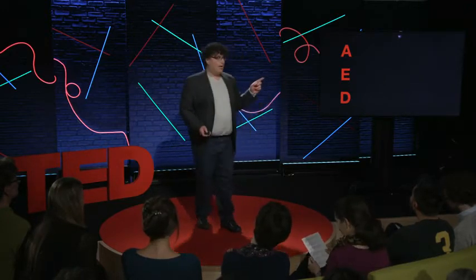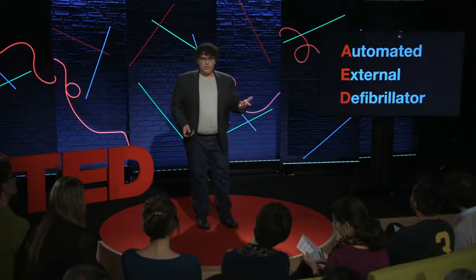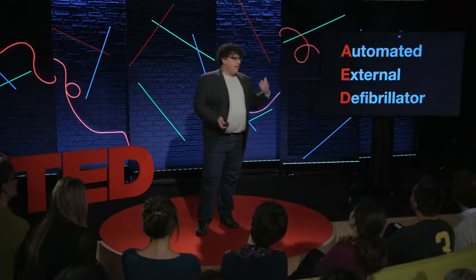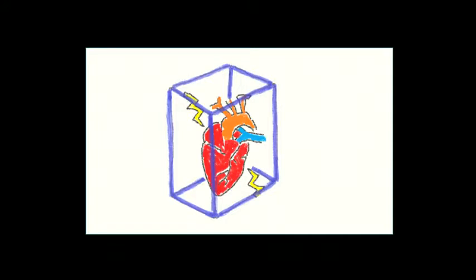But for those at home, an AED is an automated external defibrillator. It's the device used when your heart goes into cardiac arrest to shock it back into a normal rhythm. Or as one of the guys I was teaching a class to referred to it, the shocky hardy box thing.